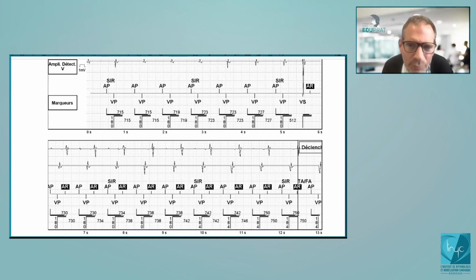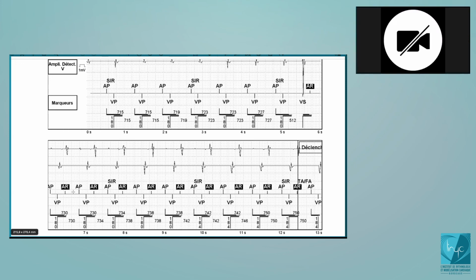Yes, I think this is more or less the only solution because if you want this not to happen, you will require that this signal is not AR but AS. If it is AS, then it will inhibit atrial pacing and it will stop. But if it is AS, then there is a risk of what? Of, I'm sorry, of PMT.